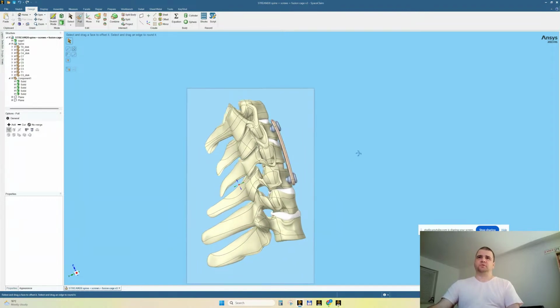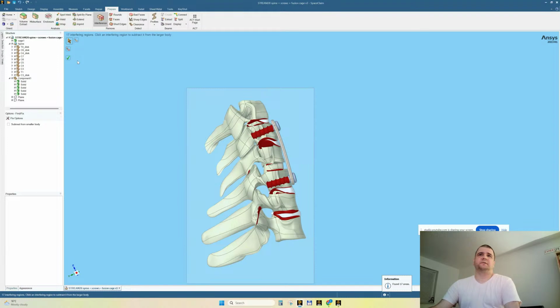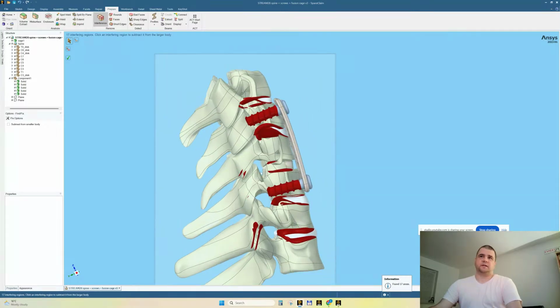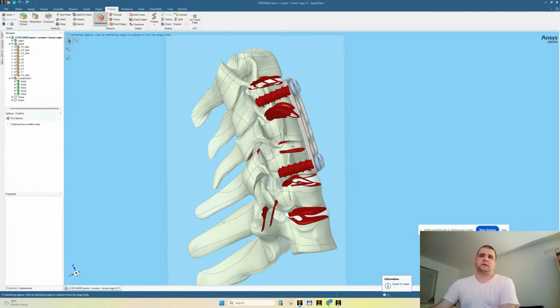The easiest way to solve everything, I'm talking about the combining operation, is this one. Repair interference. The problem with this is that by default it is subtracting from the bigger body. Look here. Click an interfering region to subtract it from the larger body.